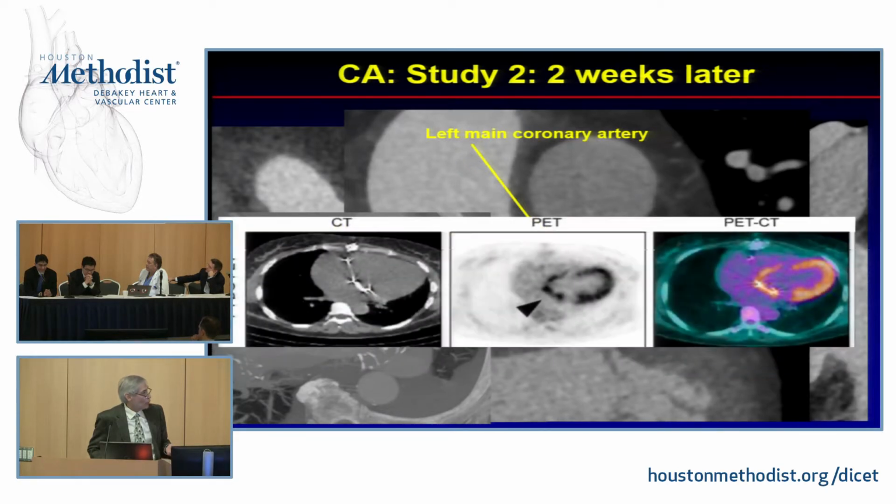And, to get at your question, Alan, there's more and more data coming with the use of FDG PET to really look at early evidence. And it turns out that the SUV levels, the amount of intensity of the FDG uptake, is a pretty good indicator of whether there is just inflammation present, let's say early after surgery, versus infection. And you can also do leukocyte imaging with PET to look at that. And when combining the two of them, you can get a very good idea. By fusing CT and PET, you can get a very nice look at that.